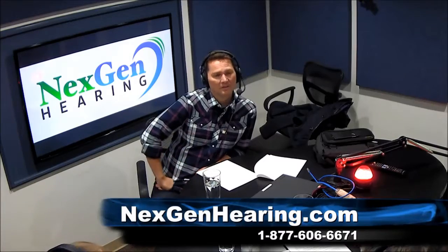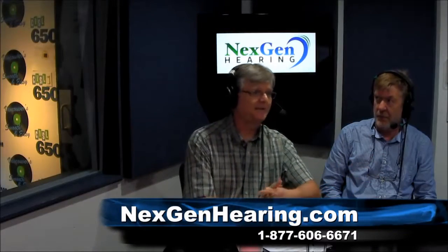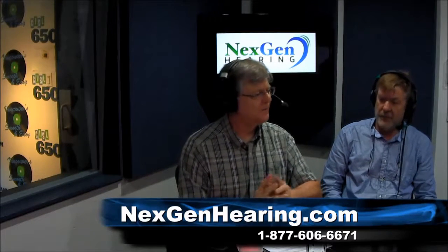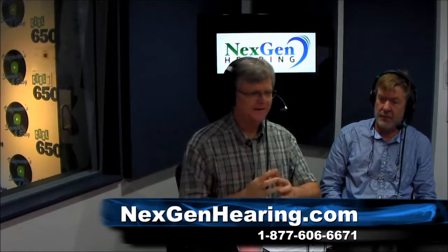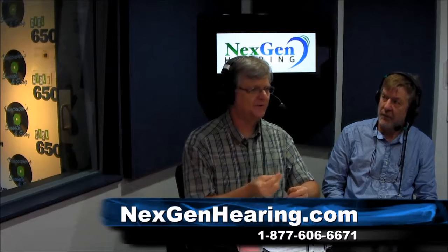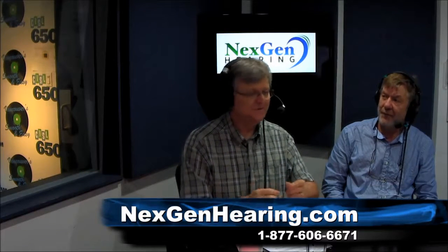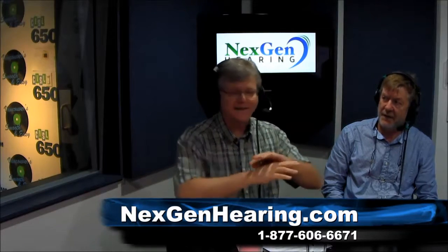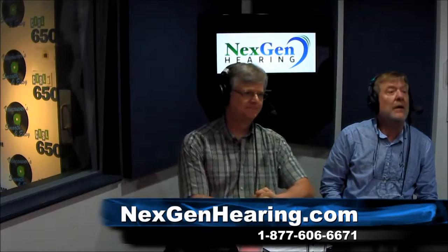Now, Mike, these people are hard of hearing, right? They're quite severely hard of hearing. So this is like a revelation when they can actually hear these distinguishing factors of speech, right? Yeah, that technology alone is a big step in hearing aids, to be able to shift those frequencies over to the better hearing. But when they use that microphone in a classroom setting, it increases the signal-to-noise ratio. You radio guys must know about that. Signal-to-noise is basically you're getting much more of the voice you want to hear and less of everything else. Oh, so it's suppressing all of the confusing sounds, right?